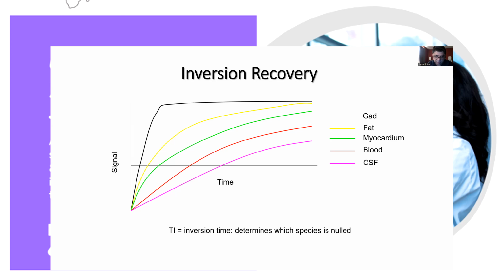So it's the difference between taking $2 from $10, where you have $8 left, and taking $20 from $100, where you have $80 left. 80 is of course more than 8. So the more signal you start off with, the more money you have, the more signal, the more contrast.